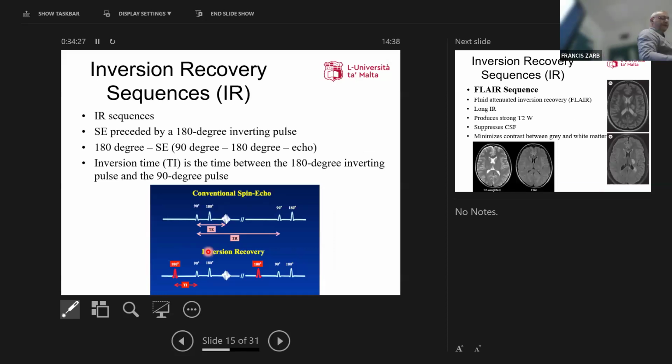Mela, before we talk about inversion recovery sequences. In spin echo we said to forget the 180-degree pulse at this stage. We send an RF pulse, so let's talk about longitudinal magnetization, because then it's the same principle for the transverse magnetization. I had longitudinal magnetization, I sent the RF pulse of 90 degrees, so longitudinal magnetization is nothing. And after a period of time, it grows back.